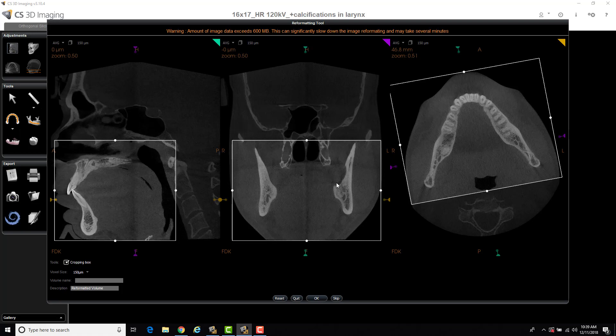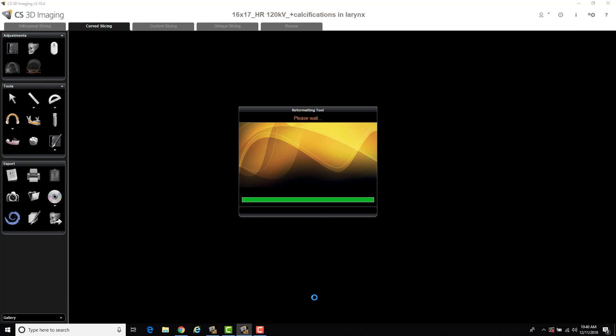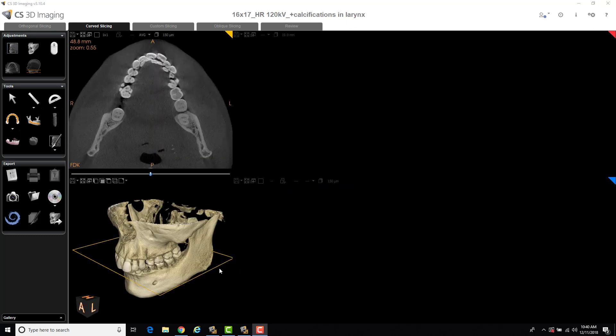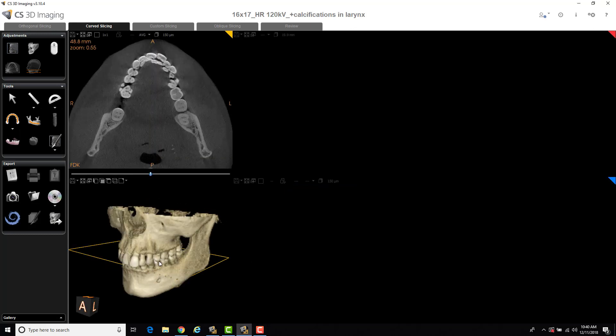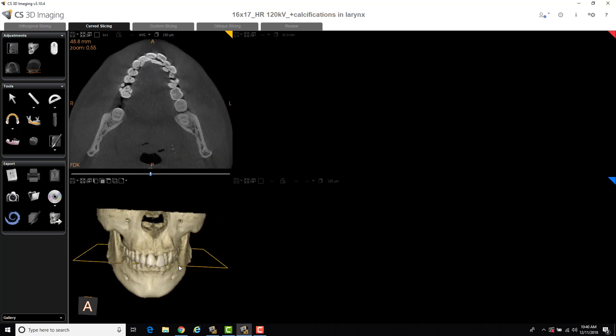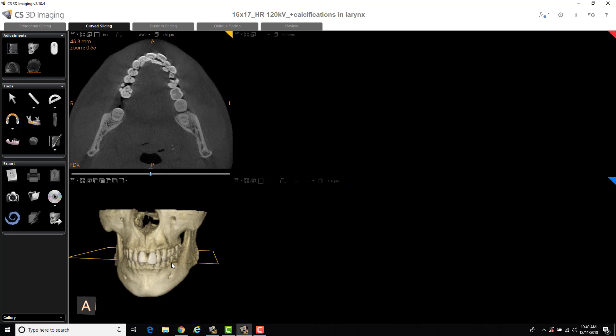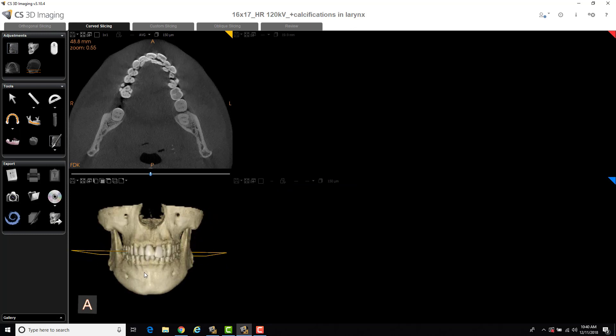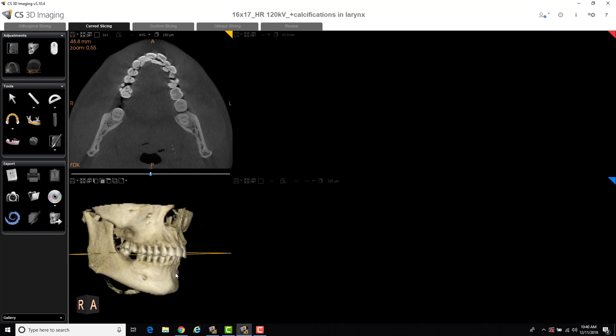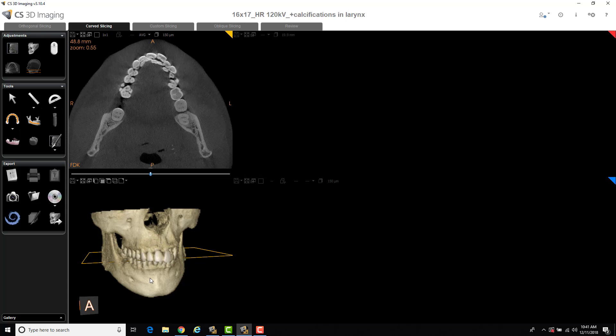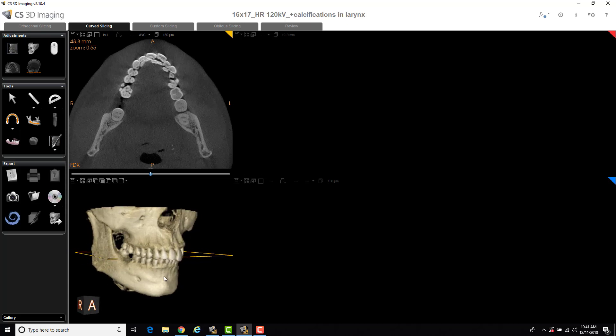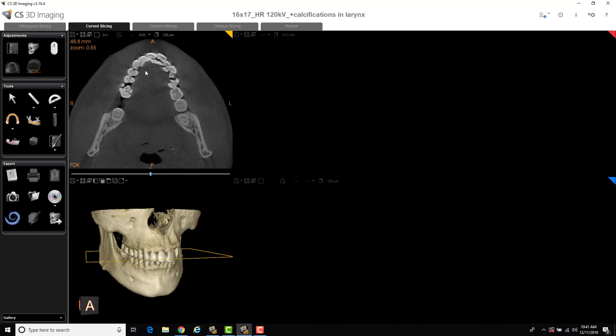After I crop that out, I can rename the volume, and then go ahead and select OK. What it's going to do is reformat and reconstruct a new volume. So you're actually going to have two volumes in your software. The first volume is going to be the original volume, and then the second volume is going to be the reformatted volume. And when it's done, you can see we've reconstructed and reformatted the volume. It opens up the scan automatically. So all that information is now cropped, and you can also see my axial view. It is aligned much better than it was previously.